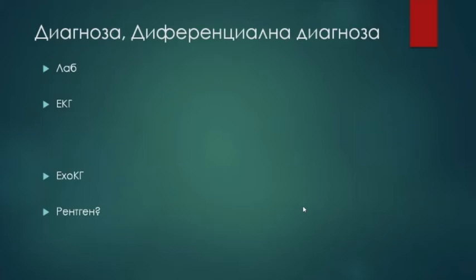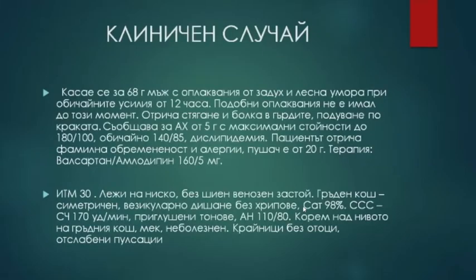Crazy high risk for every cardiovascular disease under the sun? Yes, usually yes. But the main condition here is obviously the high rate, the heart rate around 170. So we should check for rhythm disturbance or conduction disturbance.